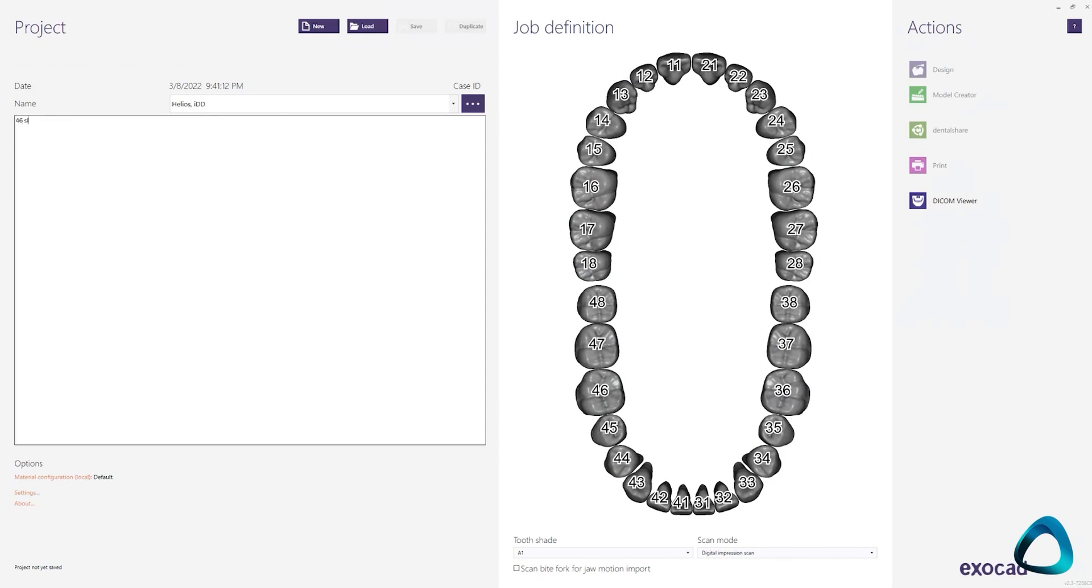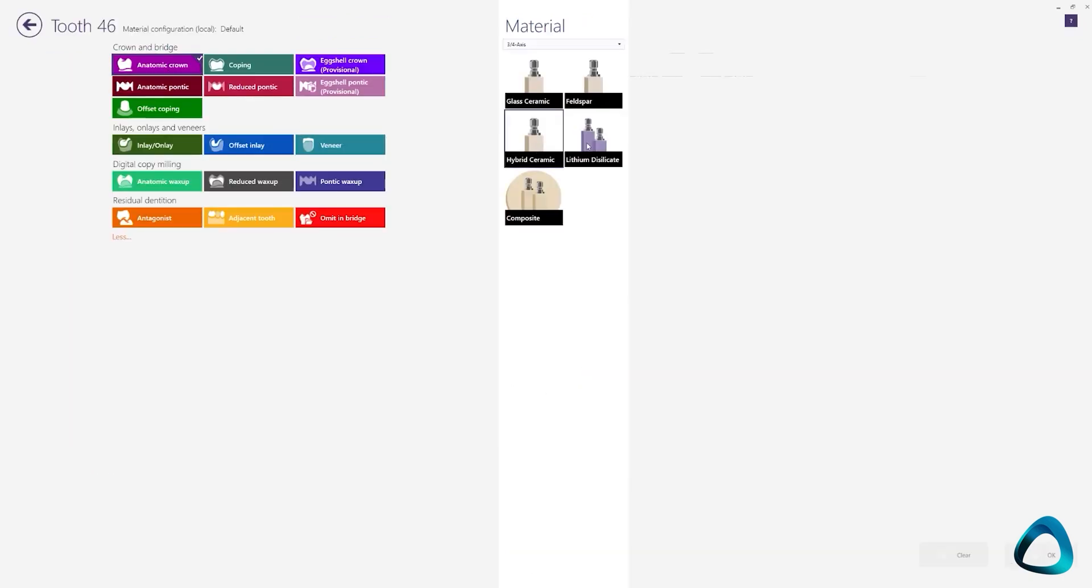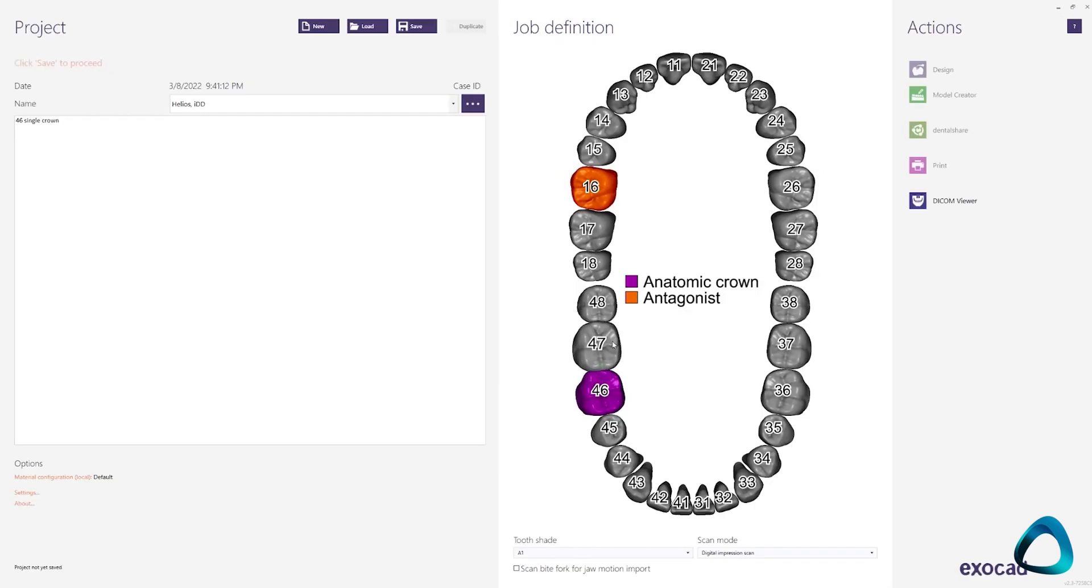Here we have scans taken with a Helios 600 intraoral scanner, and we want to provide a same-day crown to our patient. So we will use Exocad software to design and fabricate the restoration. First is the case setup and indications. This is like your lab form. Fill in all the appropriate patient and case details and then you can move forward with the workflow.